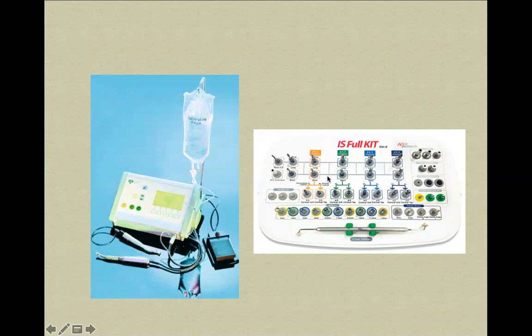This set of the drills will include the drills with a different diameter. As you can see here, this is for 3.5, this is for 4.0, 4.5, 5.0, and this is a pilot drill. Why do we need this set? Maybe it is also very important to note that you cannot start with 5.0.